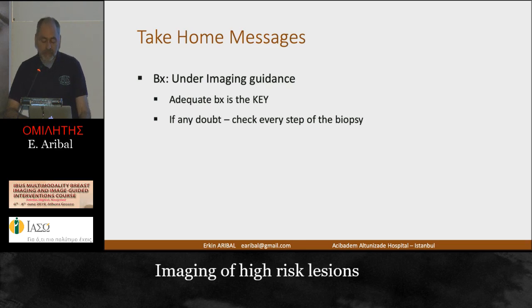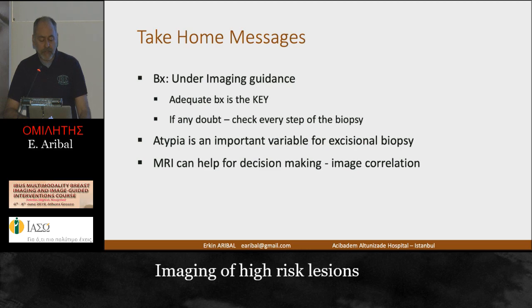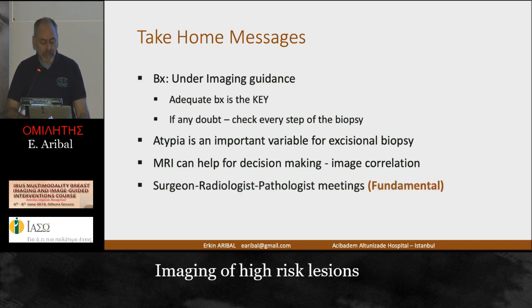If there is any doubt, check every step of your biopsy. Atypia is one of the important variables for excisional biopsy, and MRI can help for decision making, with image correlation with your mammogram and ultrasound findings. Particularly contrast-enhancing non-mass enhancements are important in the decision-making process.